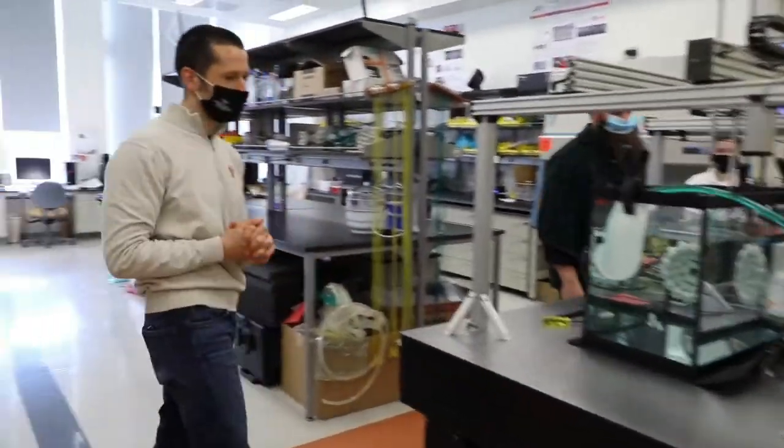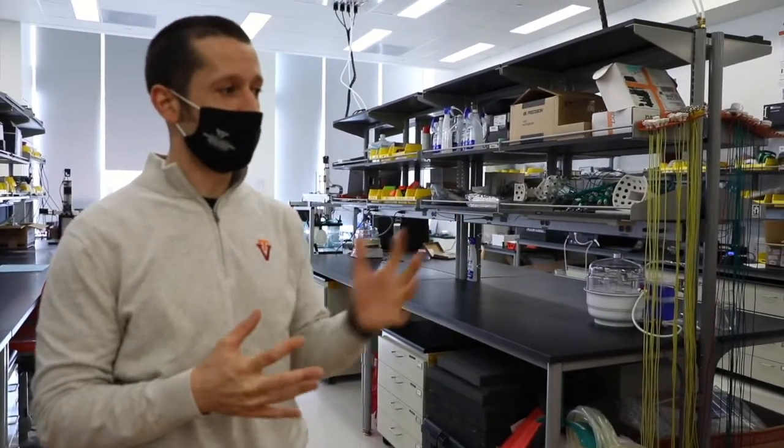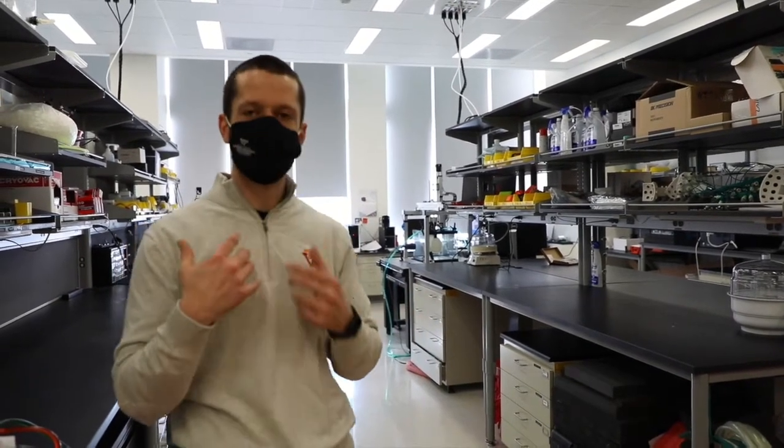Connor and Maggie here will show you some examples in a second. But basically, our lab is a focused ultrasound lab. So this involves, for most applications, cancer right now, as well as some other clinical applications. But for those of you who are familiar with ultrasound imaging, it uses really low pressure sound waves that are put into the body and reflected back to create an image. And that's how we do medical diagnosis using ultrasound.